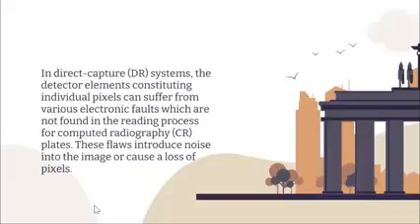So for example, your pixels fail to function. Okay? So this can be avoided. The artifacts that are caused by these electronic faults in your pixels, pixels that died or short circuited, can be easily compensated by your pre-display processes, or the processing of the image, editing the image before it appears on your monitor.